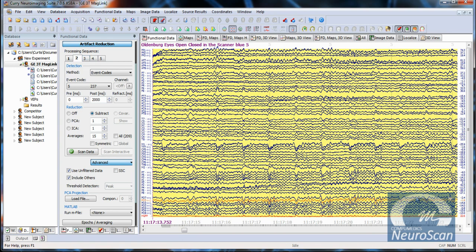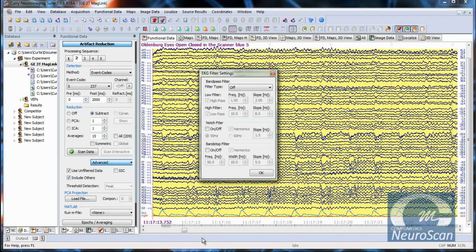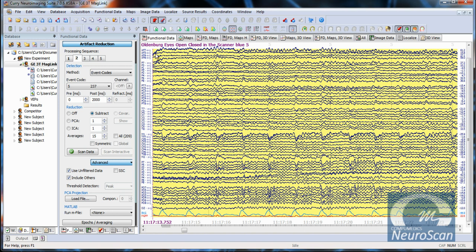The next step that we want to do is to suppress the ballistocardiogram artifact. I've done a little pre-processing on the EKG channel here by selectively filtering it. So let's go to filter frequencies. And in essence, in a user-defined case, I've gone from 1 to 10 hertz to stabilize it. So we can turn this on. And now, when we are on step 3, we will come to the threshold method again.